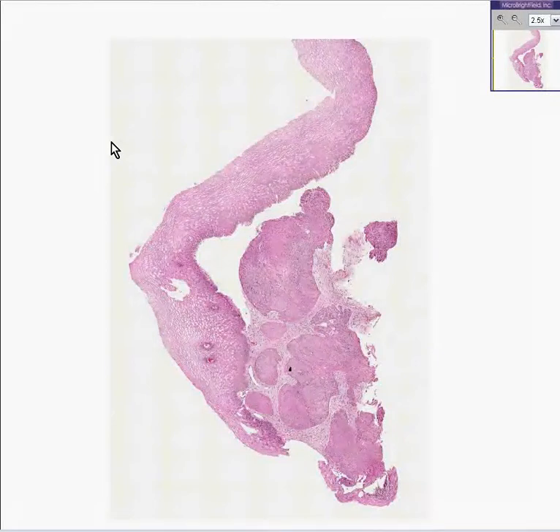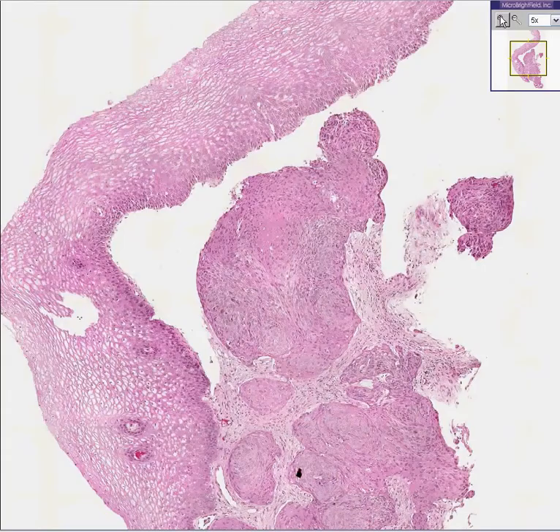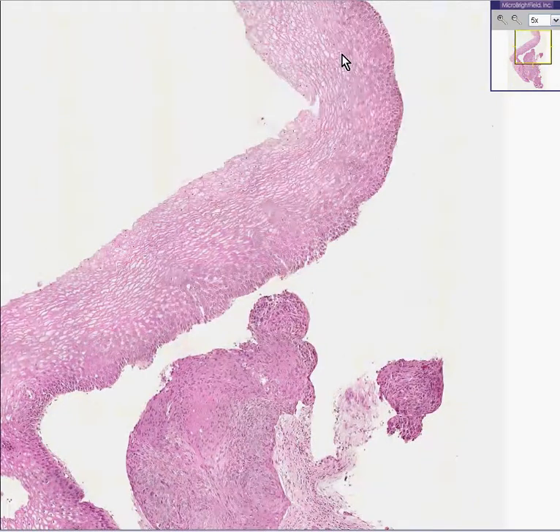This slide, or this case, is entitled Cervix Squamous Cell Carcinoma, but let's not believe it. Let's figure it out for ourselves. In fact, let's see if maybe the book is wrong. Well, let's start out with the easy thing.